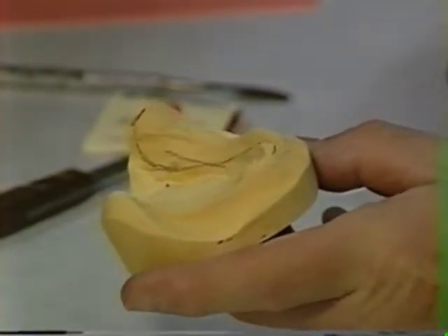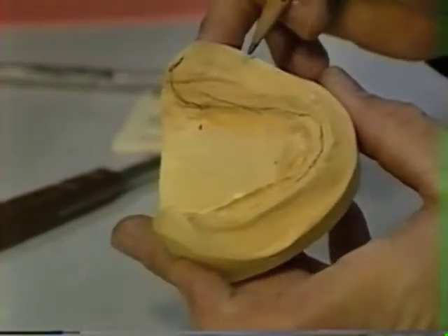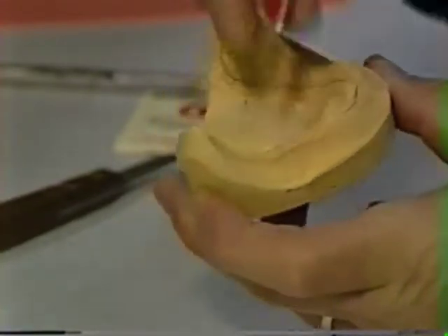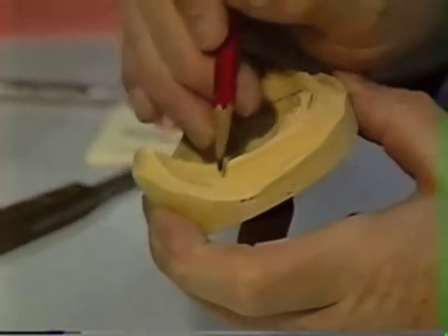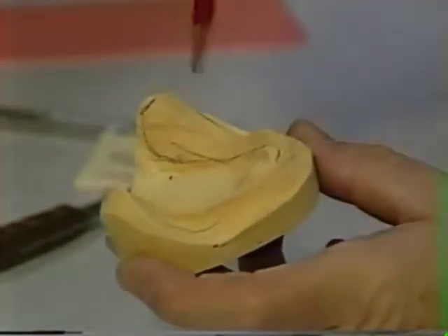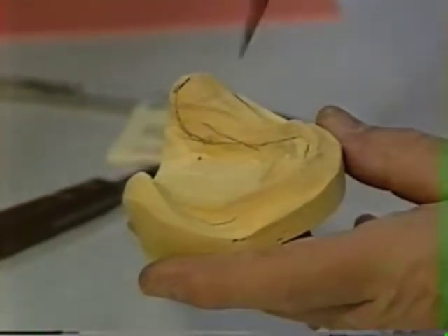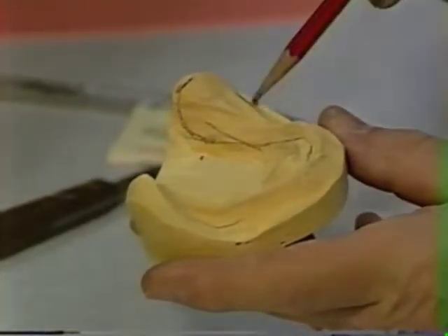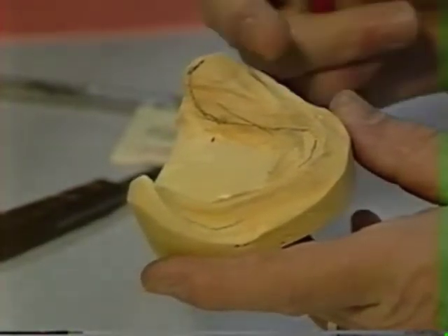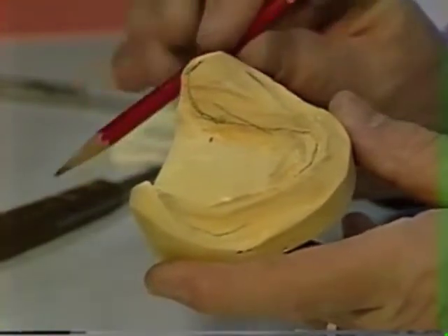Now let's look at the facial surfaces of it. We want to remember that first of all we want to identify the external oblique line, which is coming right here. On each side we can see the external oblique line right about there. We want to remember that at the distal buccal, in other words just lateral to the retromolar pad on each side and outside of the external oblique line, you're going to have a large muscle laying right in this area like so. That muscle is the masseter muscle.